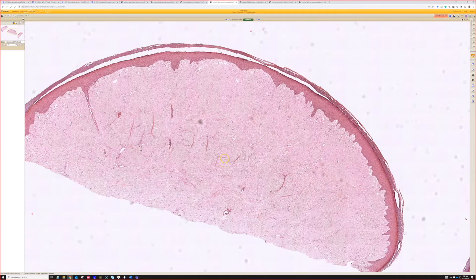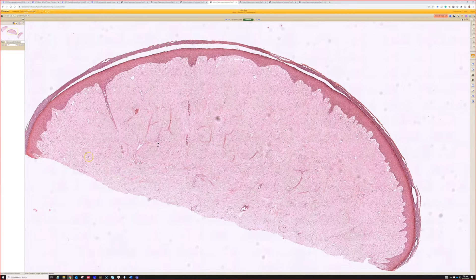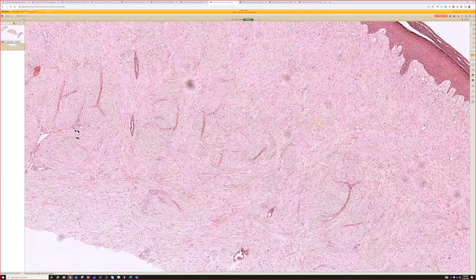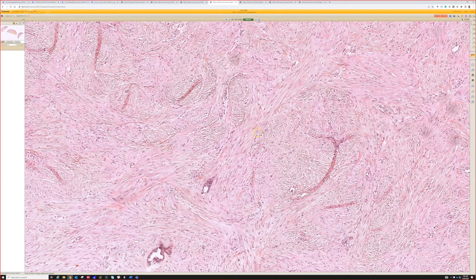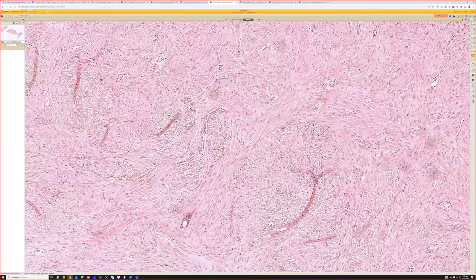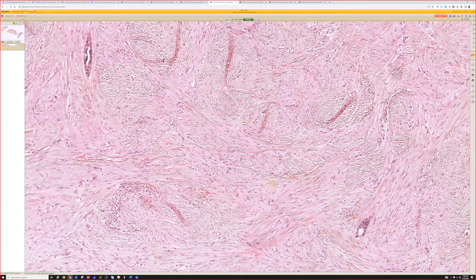We have a piece of skin that is perfectly rounded — looks like acral skin, given the hyperkeratosis. The dermis is all fibrotic, with fascicles throughout that look somewhat eosinophilic. It's a faded older slide, but you can still tell there was collagen in the background — definitely eosinophilic pink bundles and fascicles of spindle cells.